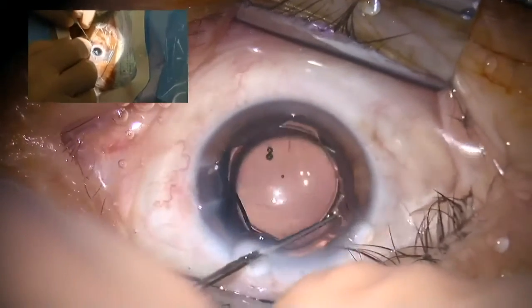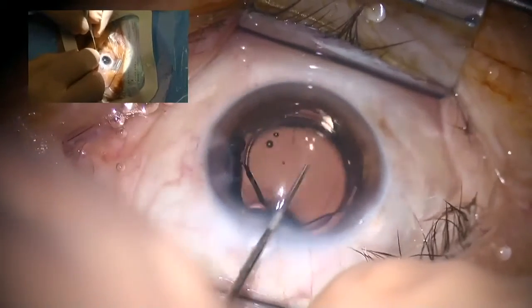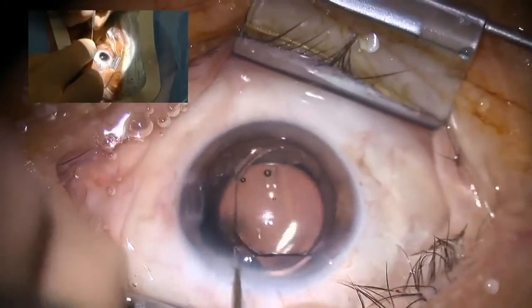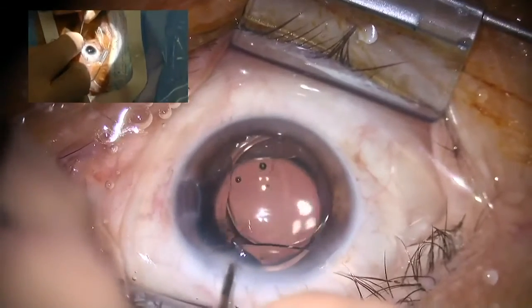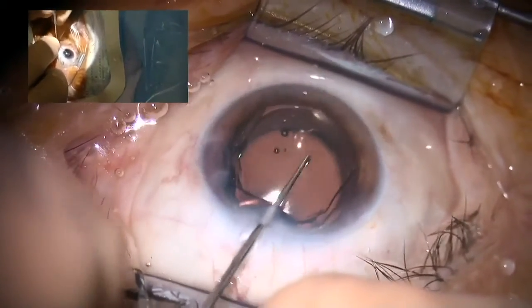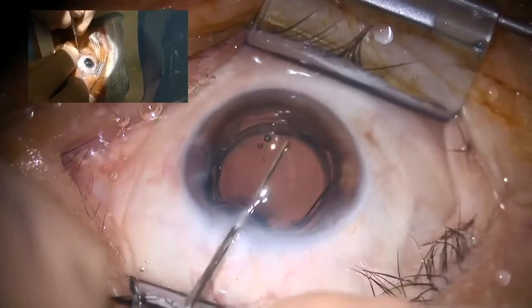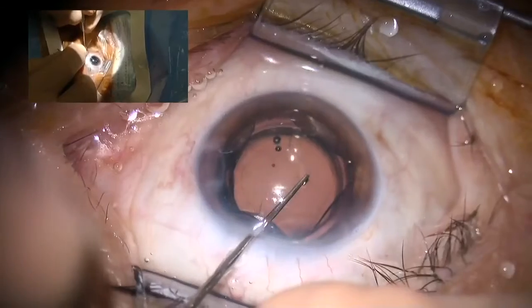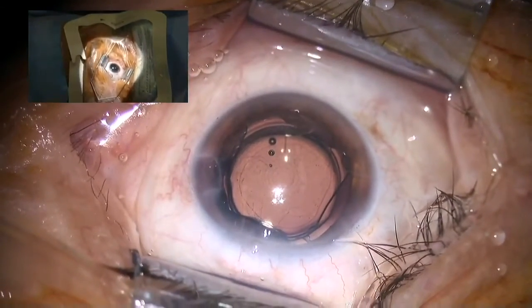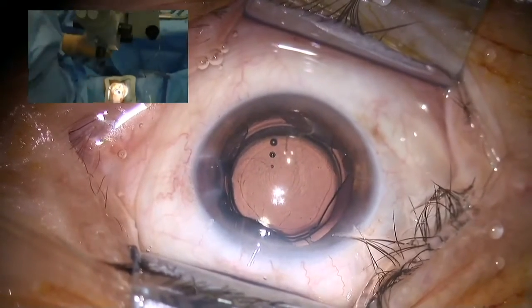Now the second one can be very, very gently and easily pushed underneath. Now you have to tell the patient that probably she can feel it, not pain. So now the IOL is in the ciliary sulcus. It's very important to rotate it a bit. You saw that I rotated it during the implantation process, because this ensures that the haptics are properly unfolded.